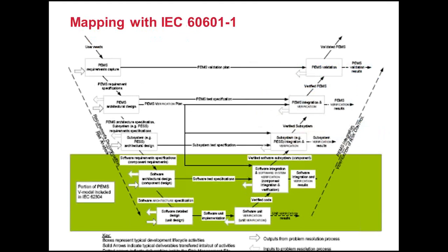We saw three standards which the SDLC process is linked with. We discussed in detail the risk management. We discussed in detail the quality management system. The third standard which we have to discuss now is on medical electrical equipment, the requirements for basic safety and essential performance.